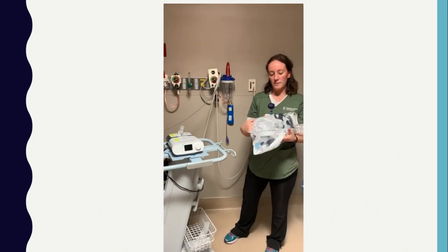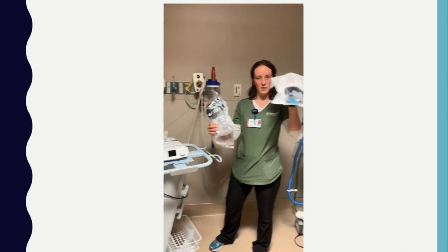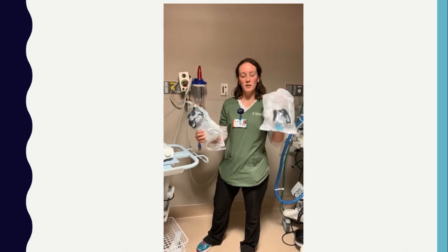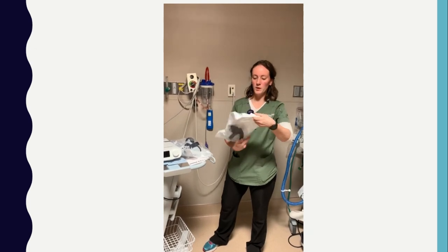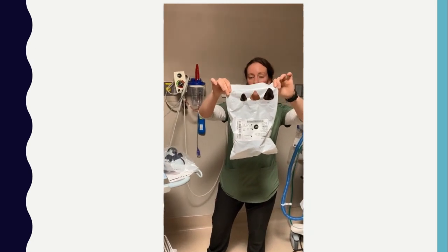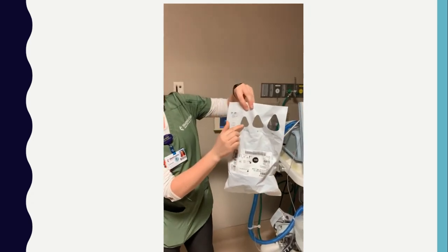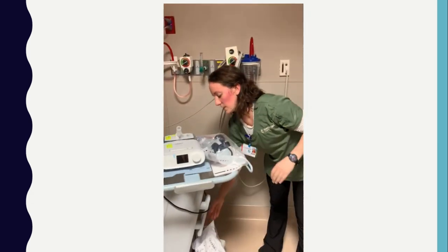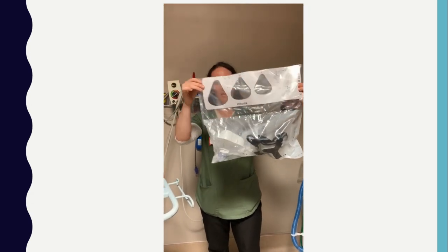We do have two types of masks that patients will use whenever they have these. We have our full face mask, and then we also have our nasal mask. The nasal mask tends to be a little bit more comfortable for patients, so if you have a patient that's claustrophobic, this might be a better choice. And they have, it's really cool, these little things right here on the side of the package. This is going to show you exactly what size mask this patient's going to need. It even has a little diagram right here that shows you where exactly to measure. You take this and you can measure it on the patient. That'll show you what size they need to wear. The nasal one has that, as well as our full face mask. So it's pretty easy to determine what size they need.